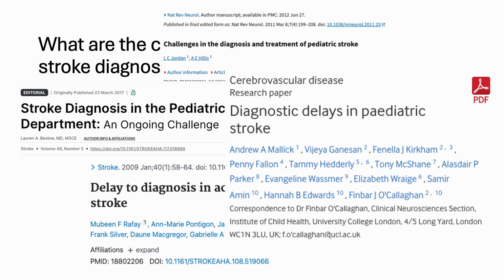The initial imaging modality was CT in 68% of acute ischemic stroke, and this was only diagnostic in 66% of the cases. MRI then was performed, which was diagnostic in all of the cases. And if the initial neuroimaging was non-diagnostic in acute ischemic stroke, then the median time to diagnosis was 44 hours.